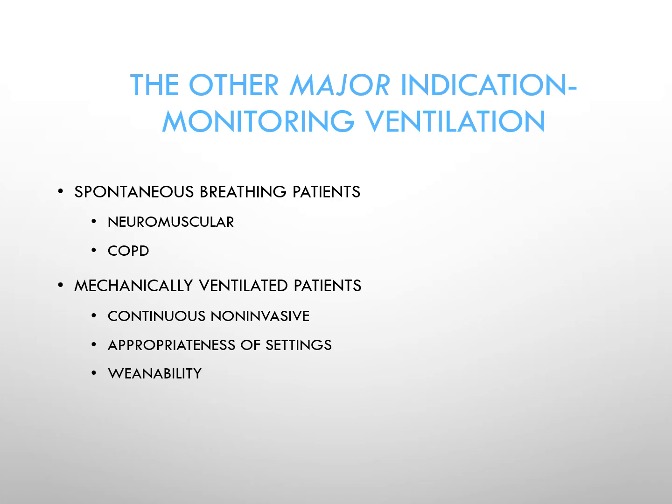There's a Dr. John Bach, who's at a university hospital in northern New Jersey. He does a lot of work with neuromuscular patients, and when they come into his office, he will invariably measure their end-tidal CO2. He has found that over a period of time, the increase in their end-tidal CO2 will correlate with the progression of their disease.